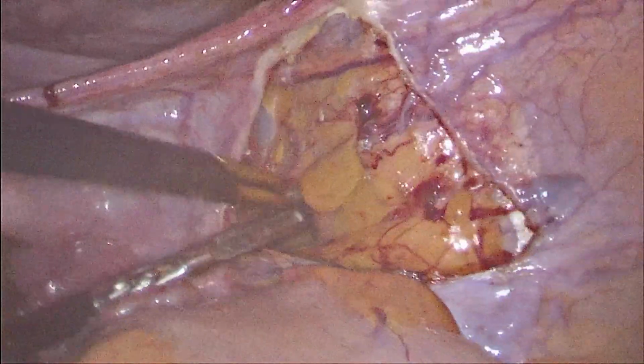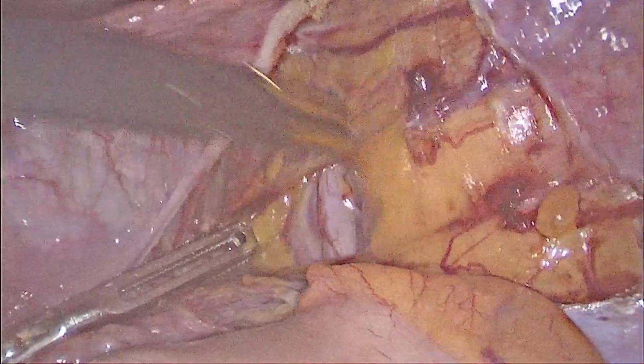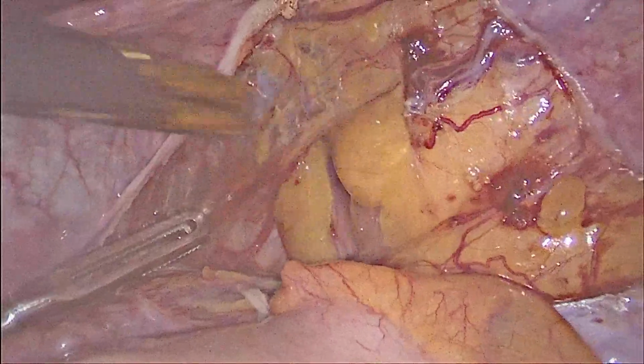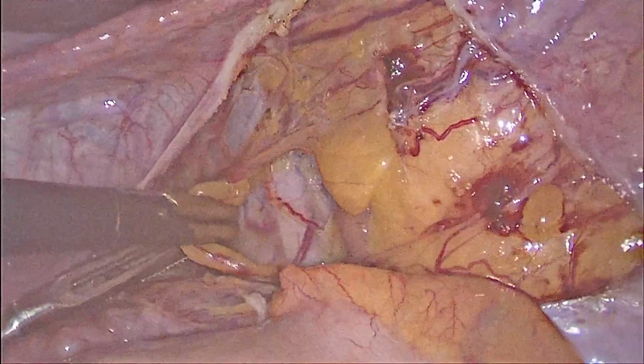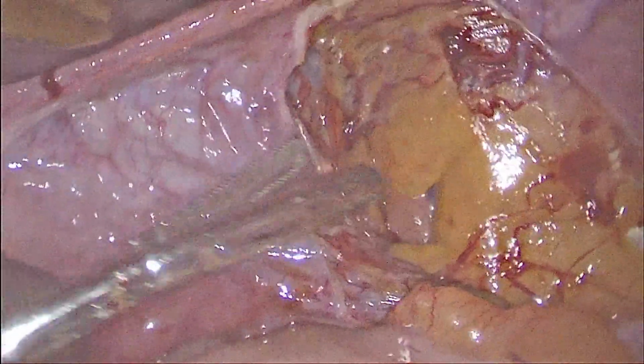In the medial fold of the peritoneum, we are keeping the ureter. Laterally, there are the internal iliac vessels and their branches.